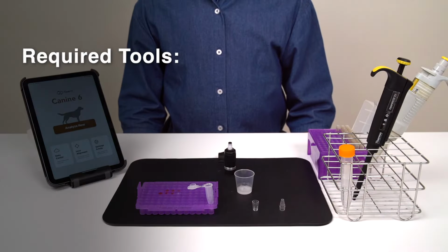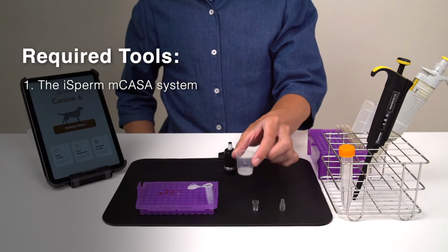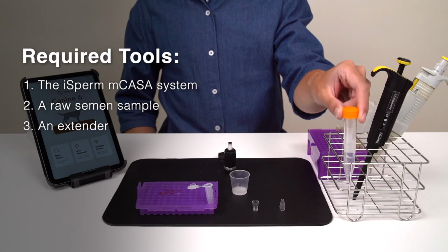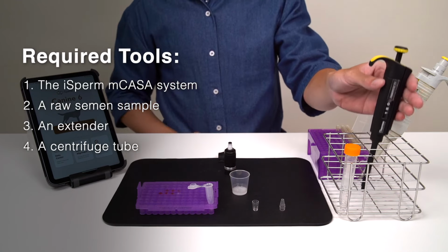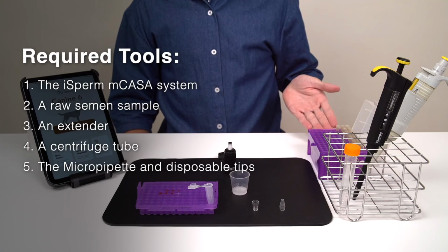To show the dilution process, we have the following items ready for use. 1. The iSperm mCASA system. 2. A raw semen sample. 3. An extender. 4. A centrifuge tube. 5. The micropipette and disposable tips.